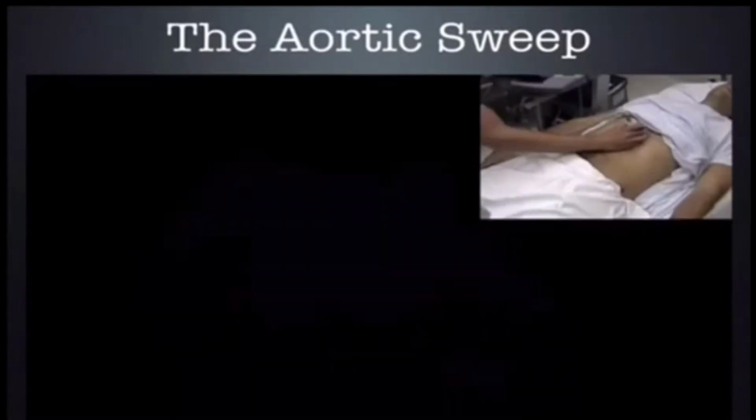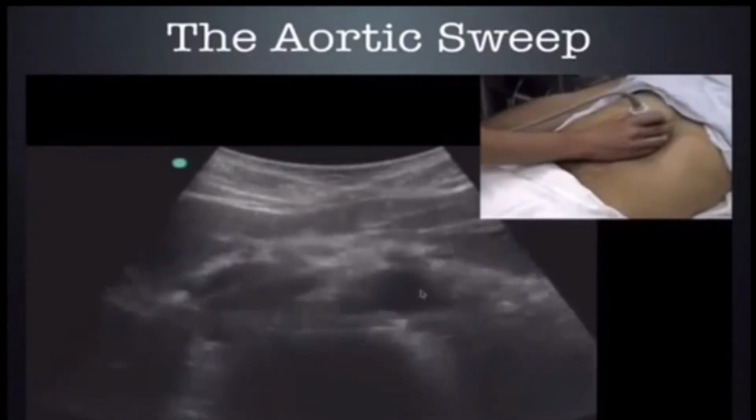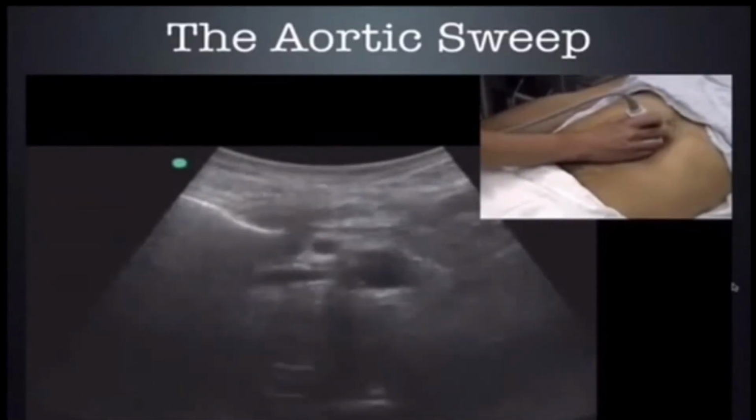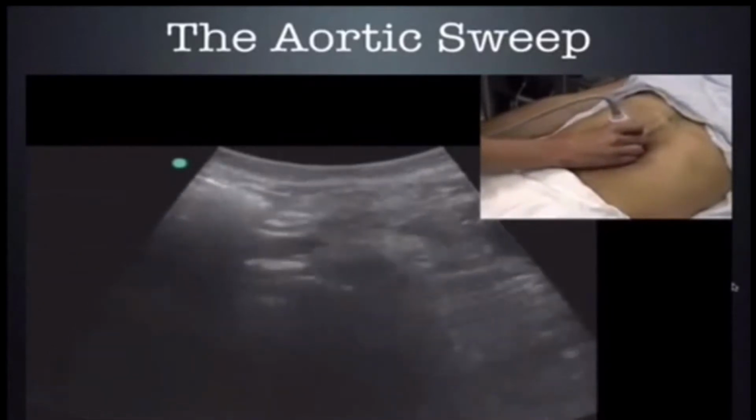Let's have a look one more time. Here's the spine with shadow. This must be the aorta. We're running down, making sure there's no obvious abnormal dilations.